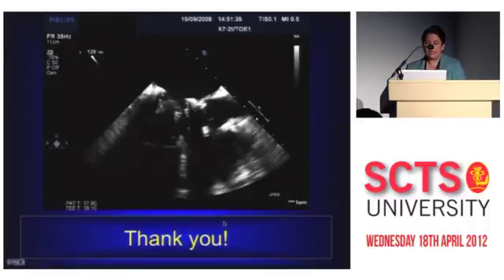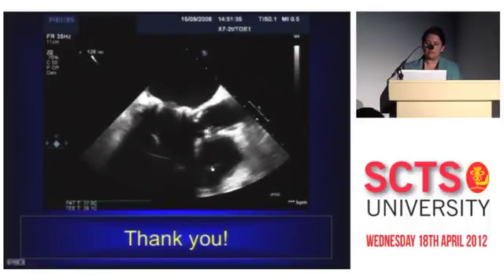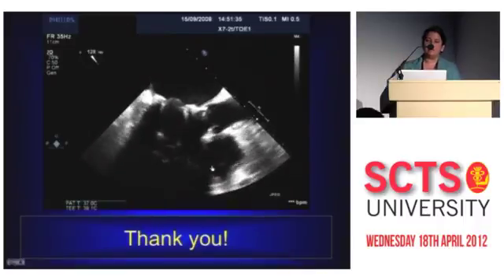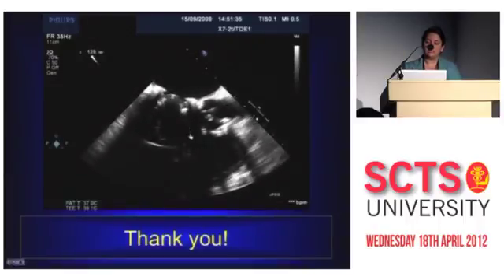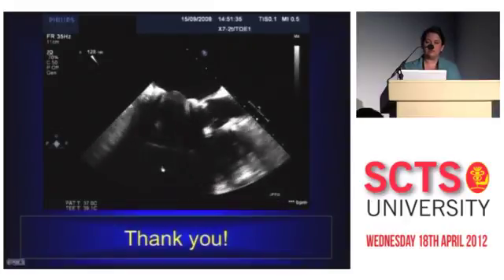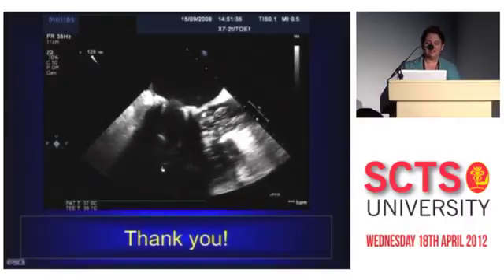So I'm going to finish there and leave you with one of my favorite images, where a core valve balloon valvuloplasty prior to a core valve is being done in a patient that you've already seen the fluoroscopy pictures of, a Starr Edwards valve. As you can see, it's done under rapid pacing, so the balloon is stable. And as the balloon goes up, filling up with air bubbles and liquid, the Starr Edwards valve just stops working completely, and the stasis that develops in the left atrium is phenomenal, really. Patient was fine, by the way, no cerebral emboli. Thank you very much.